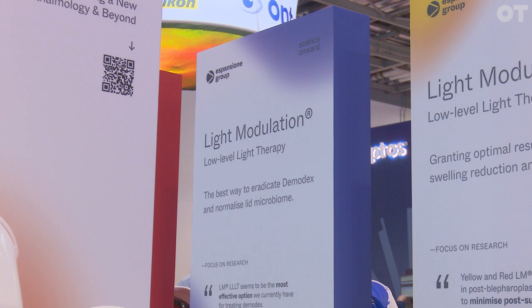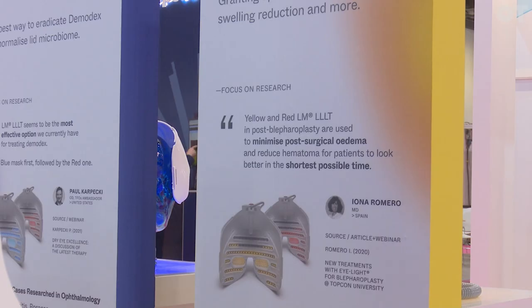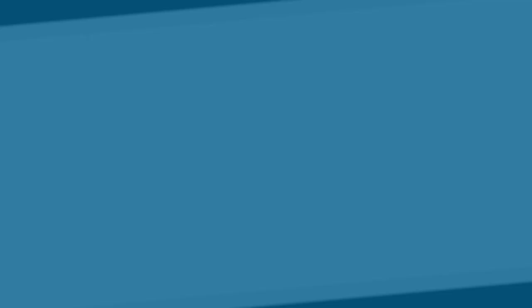This device can also treat other conditions. There's a blue mask and a yellow mask as well. With the blue mask, we can treat bacterial conditions like Demodex, and we can treat chalazia and styes. With the yellow mask, we treat symptoms of swelling, such as post-blepharoplasty treatments. The device always stays the same — the mask changes. So it's multipurpose in terms of its use, and the mask just delivers different colours of light to treat different conditions.